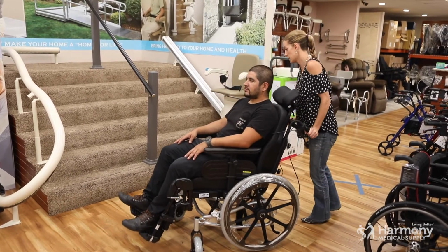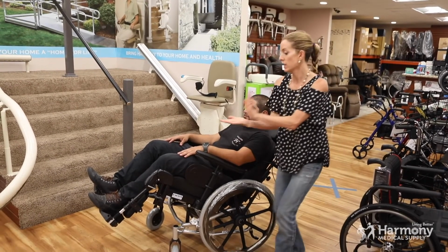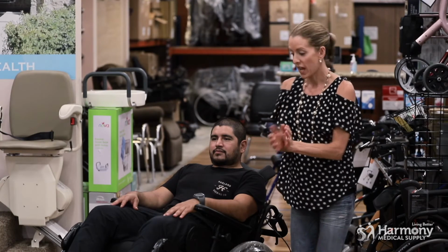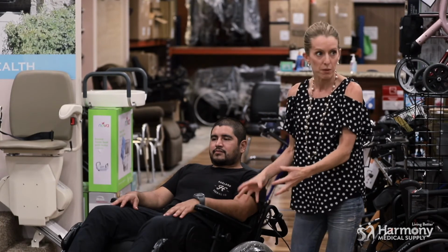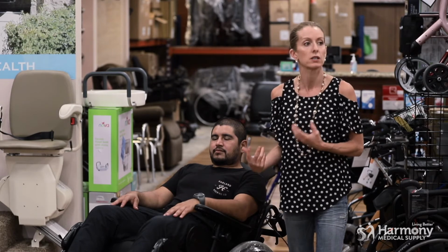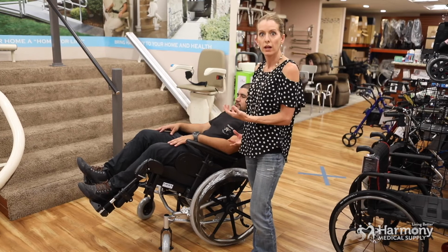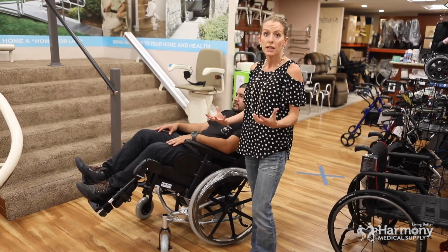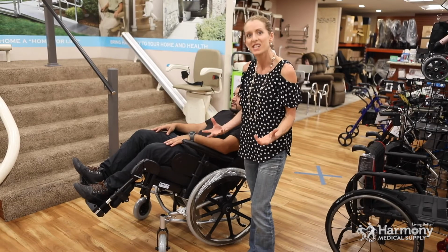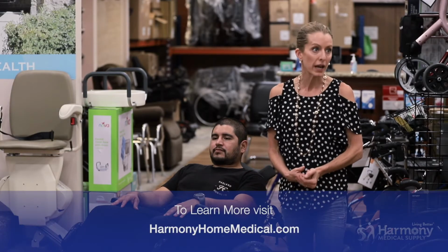So tilt takes the entire chair and moves it in space. So the seat of our chair and backrest just went boom. And what did that do? It took the weight from his bottom and put it into his back. So it distributed the pressure that's going onto our sit bones all day and moved it into our back, which is a little more meaty for some, but just less utilized for most, so it can bear that weight for a time and give our bottom a break.